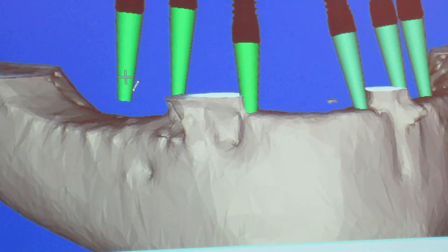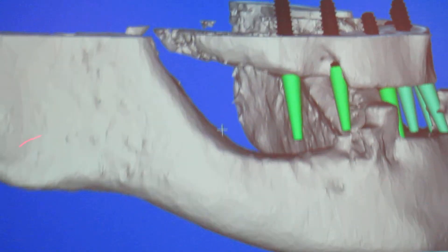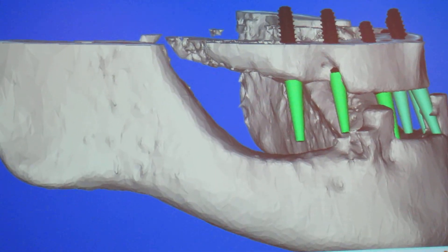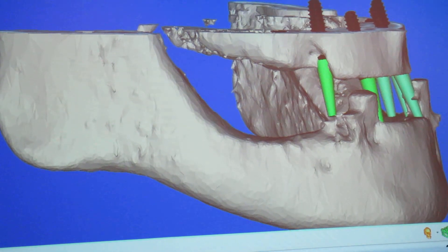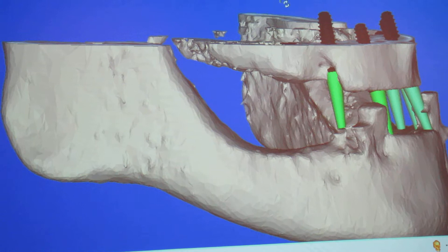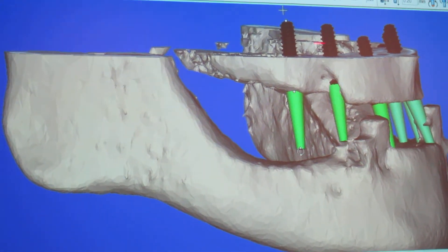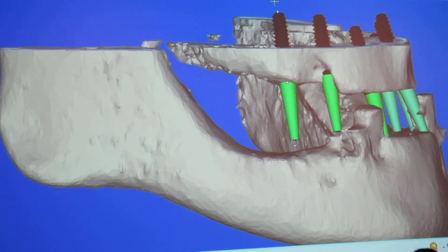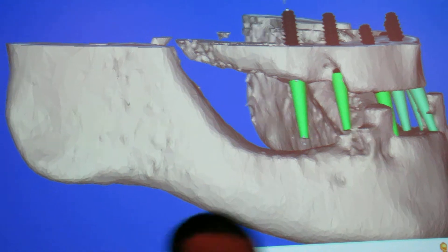We can go in and we can start to tweak the position of the implants. We'll rotate this a little bit towards the mesial so that it would be a little easier for the prosthetic components to go on.